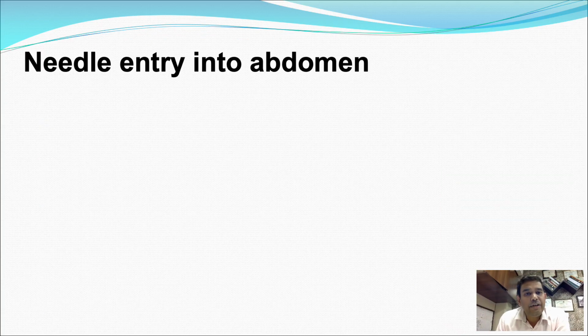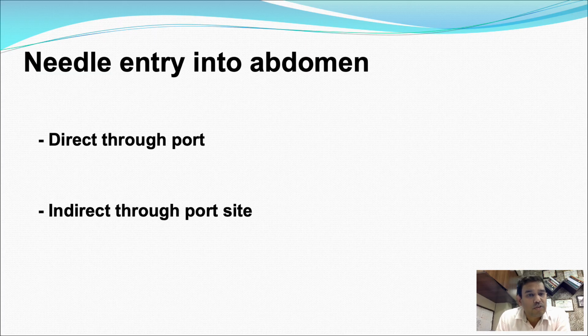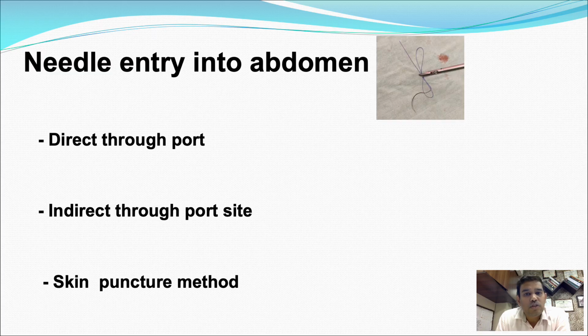Now, how do you enter the abdomen with the needle and suture? There are various techniques. I'll describe three. First is direct through the port, where you insert the needle with the thread through the port. Second is indirect feeding through the port. And third is direct puncture of the skin. So this is the way when you directly insert the suture and the needle through the port.